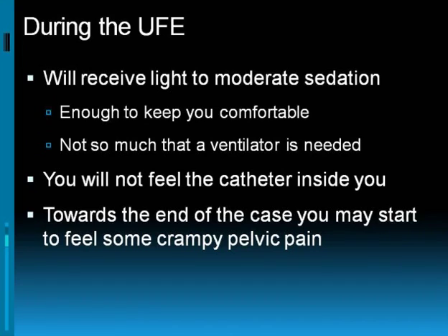The reason for that is that, for one, we need your help during the procedure. Occasionally we're going to ask you to hold your breath while we take some pictures. And secondly, if we give you too much medication, in other words a general anesthetic, you'd have to be put on a ventilator, and it's really not necessary to do that.